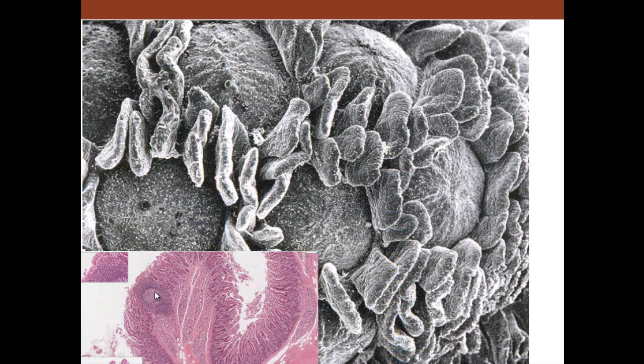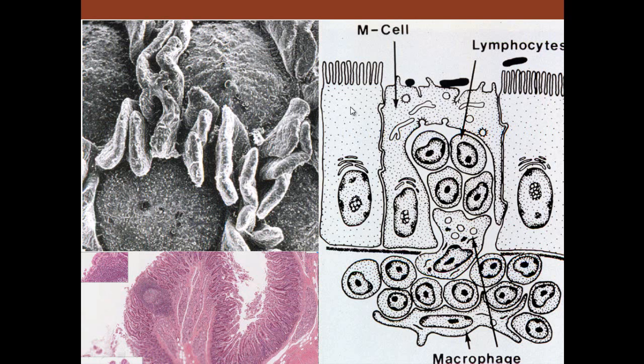So speaking of the lymphoid tissue, T and B lymphocytes that we see in through here can be in the submucosa or they may be in the lamina propria, but the surface epithelium is a little modified. So we can see that the surface epithelium is a little different, and we call these M cells.